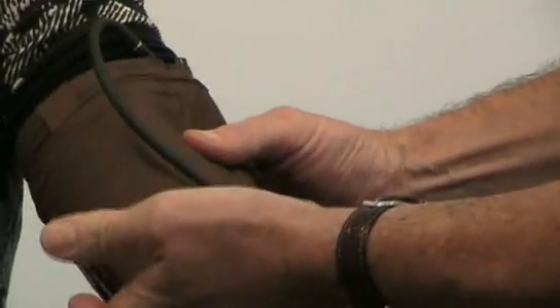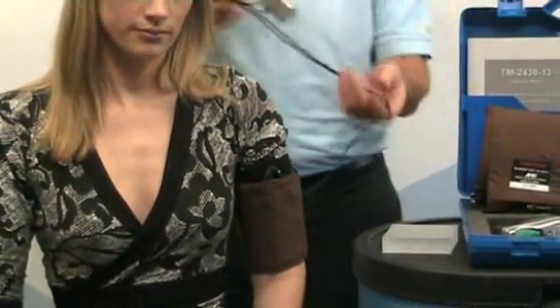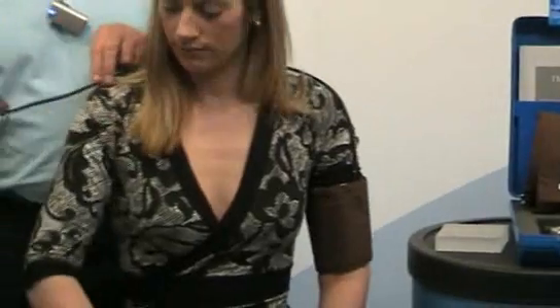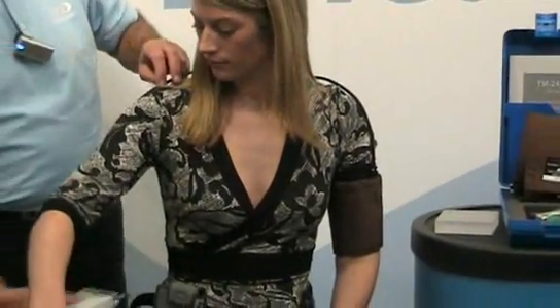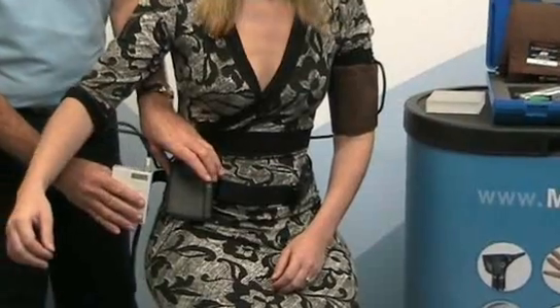You should be able to squeeze one or two fingers up the inside of the arm to allow the patient normal movement during the working day. The tube is then placed under the garment, attached to both shoulders, so that it would appear by the waist on the opposite side next to the holster.